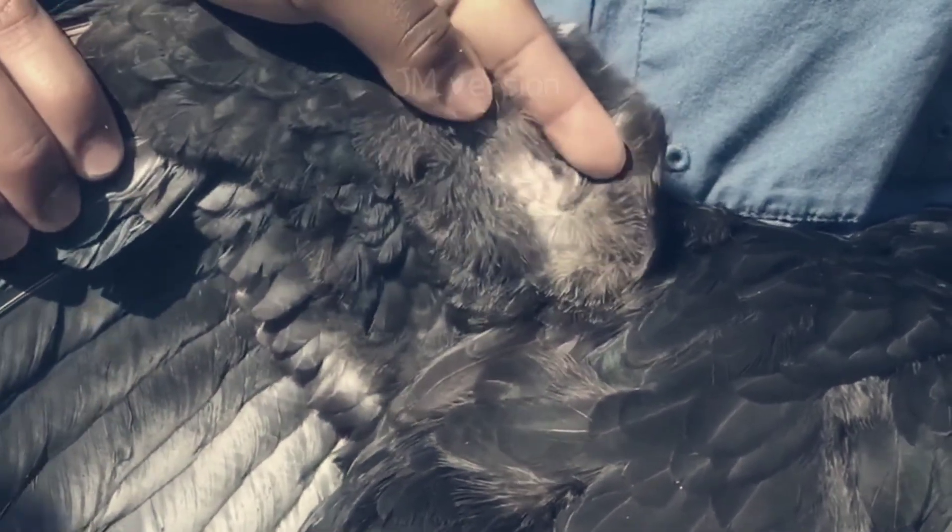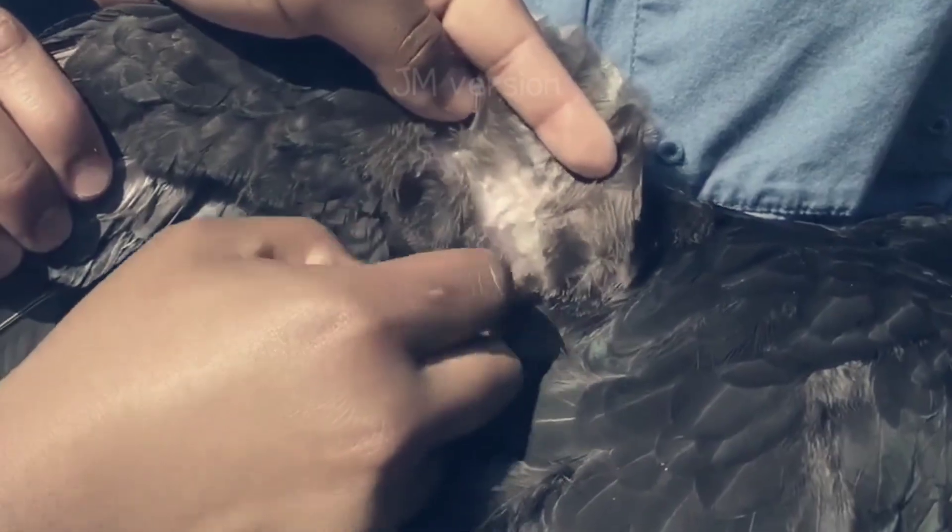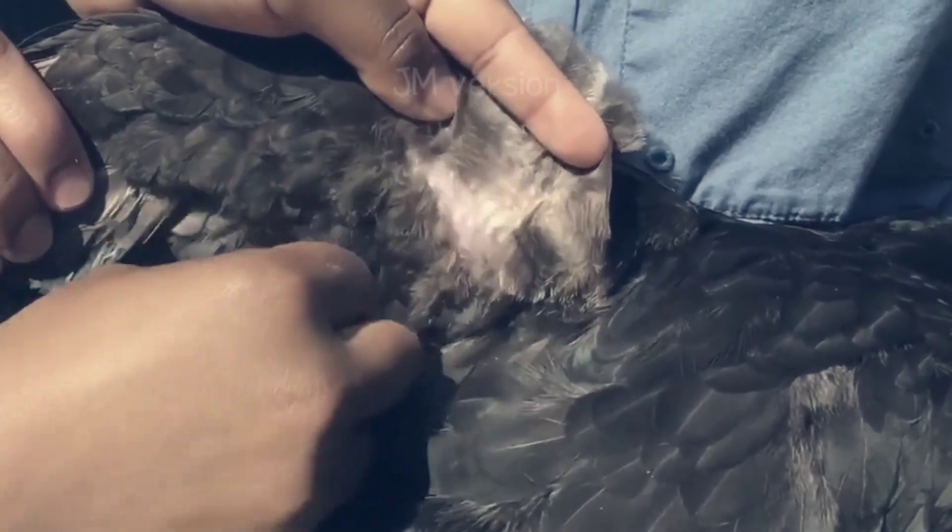Pluck a few of the smaller feathers in the wing web in order to allow your vaccine to come in direct contact with the skin surface.